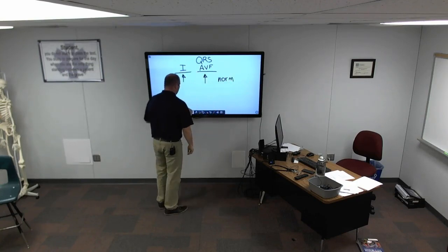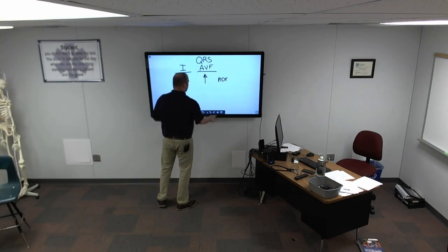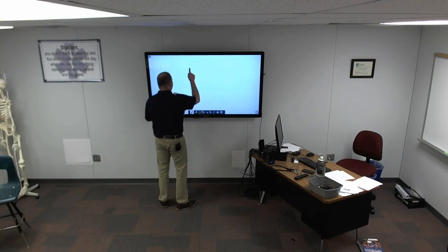Okay? Now, hang on, let me just try this. So, that was normal. Up and up is normal.